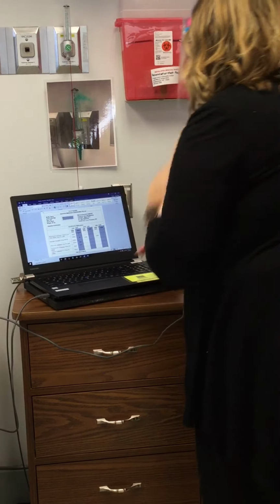Next we have digoxin, 0.125 milligrams PO. Let's do it at 0600. And it's not expired. My barcode is good. And this one's not going to scan either. So we'll say it beeped, and put some numbers in the box.